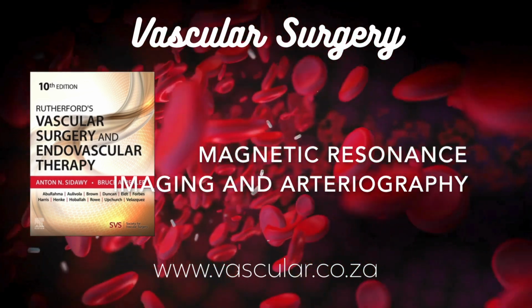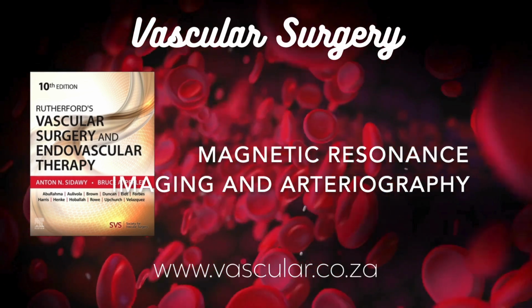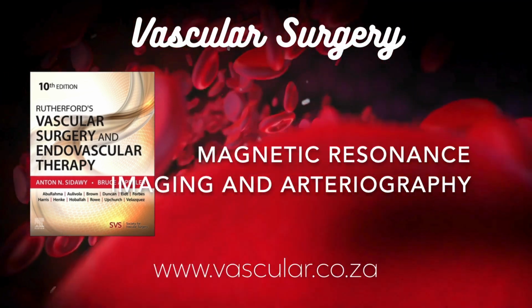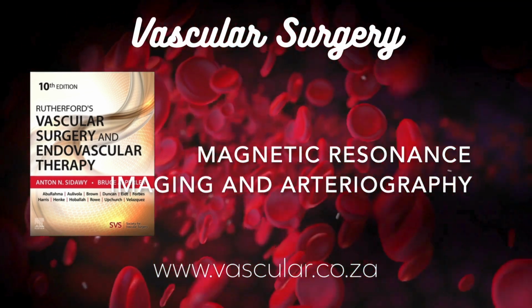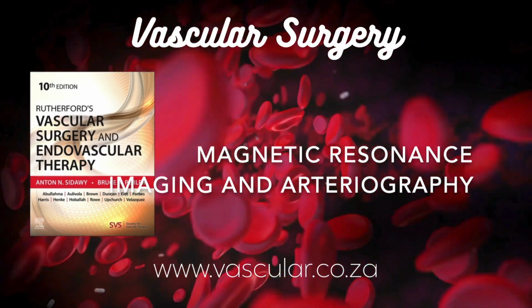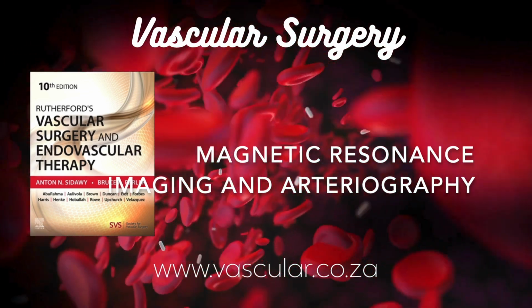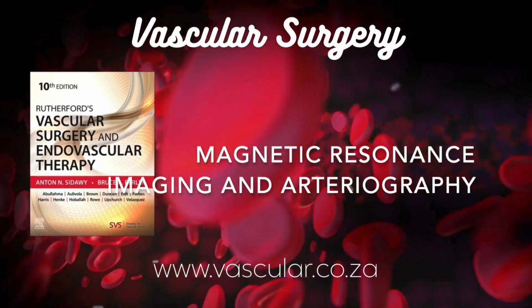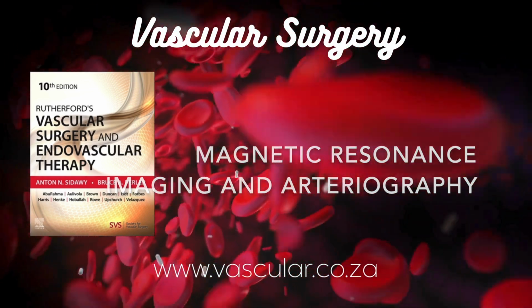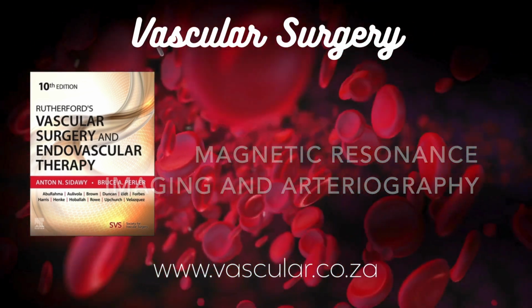So magnet aligns, gradients locate. What about the RF coils? Right, the RF coils. They act as both a transmitter and a receiver, like an antenna. They transmit radio frequency pulses at that specific resonance frequency of the aligned protons. Giving them a little nudge, sort of. Exactly, a little energy nudge. Then, when these excited protons relax back to their aligned state, they emit a tiny signal of their own. And that signal is detected by the same RF coil, or sometimes a different receiver coil. So send out a specific radio wave, then listen for the echo coming back.